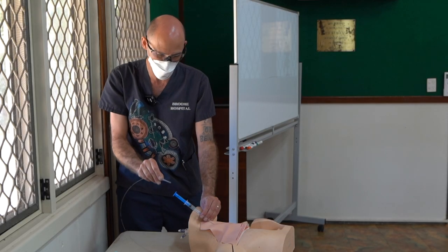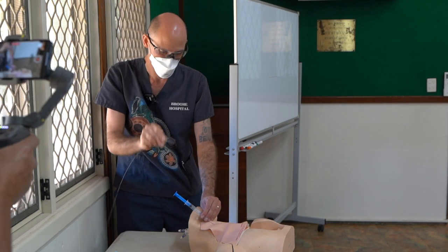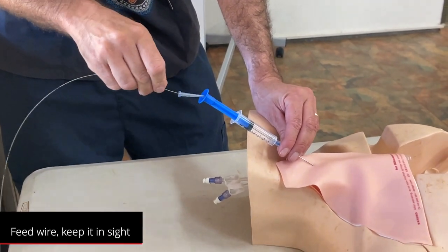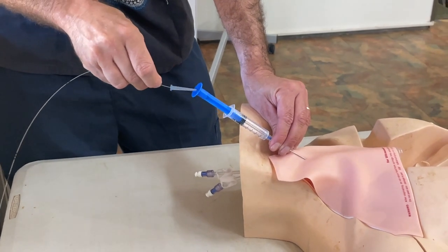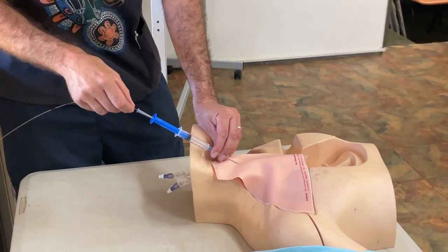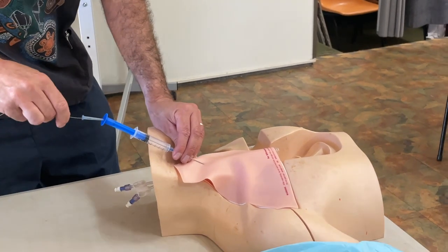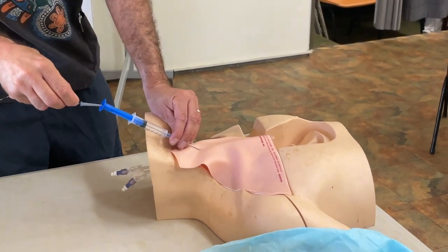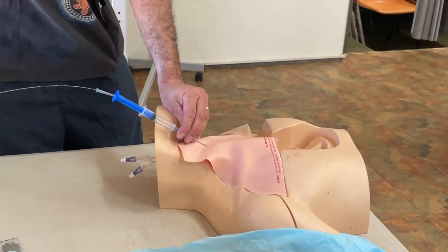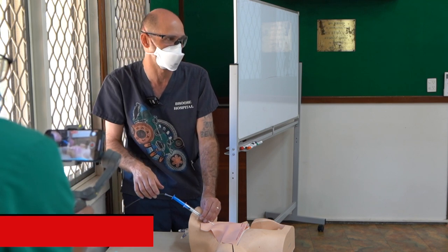I feed my wire, with a little introducer at the tip — it goes in the end of this syringe — and I feed my wire down. Is it ever hard to feed your wire? Do you ever hit resistance? If you hit resistance, something's not right, so stop and start again. If you can't go any further, you're probably in the wrong spot — it should be really easy to pass. When you're doing that, watch the screen for heart rate and heart rhythm, because you can tickle up the heart by putting a wire into it and cause an arrhythmia.